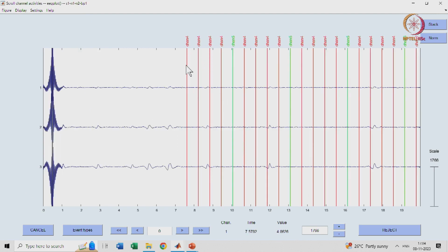And this is a very important thing. You can see that all the events 4 4 4 5 4 4 4 5 are repeated, which means 2 types of sound are being presented, ba ba ba ba da, like this. So how your brain reacts to that change, the auditory change, that is what MMN is all about.